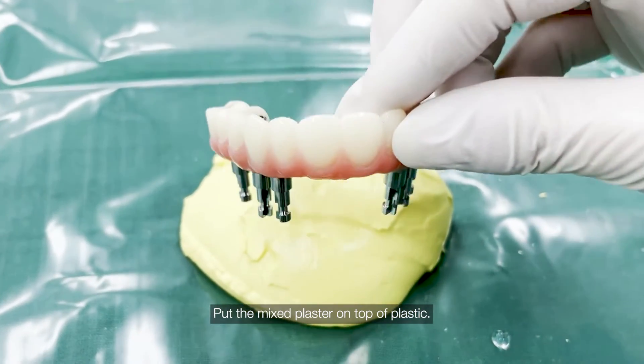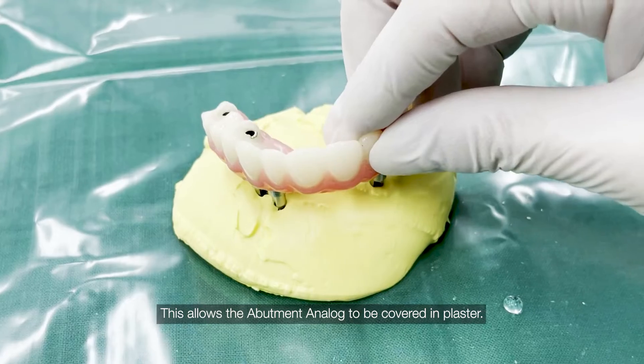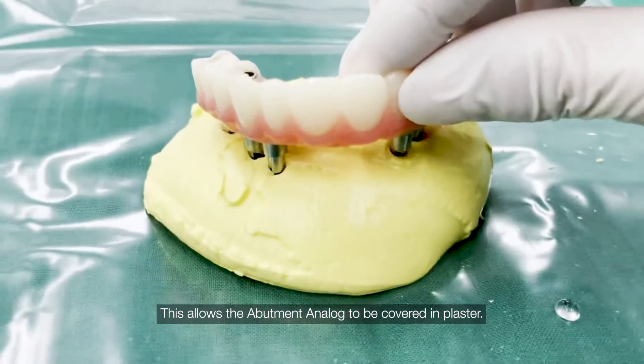Place the provisional bridge with abutment analog on the plaster. This allows the abutment analog to be covered in plaster.